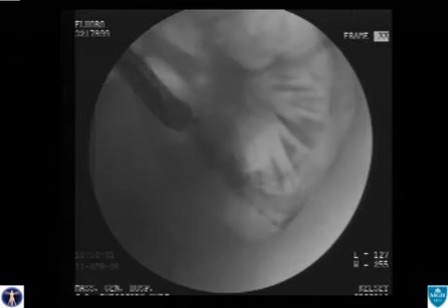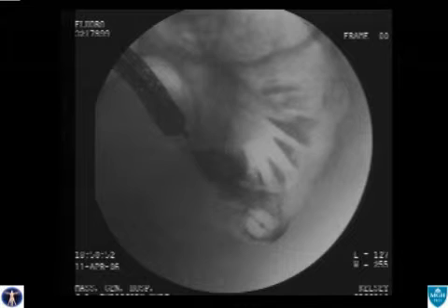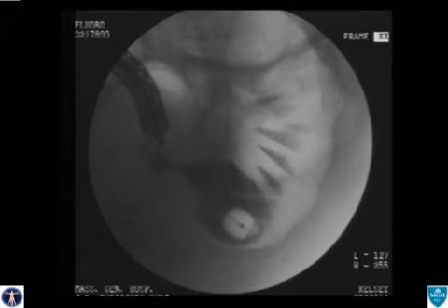Similarly, in patients with sigmoid obstruction due to diverticular disease, the enteral stent can convert a 2 or 3 stage operation to a single stage resection. Enteral stents have also been placed in malignant disease as definitive therapy for end-of-life palliative care. And finally, there has been a more limited experience using these stents in the long-term management of benign disease, although only in selected situations.